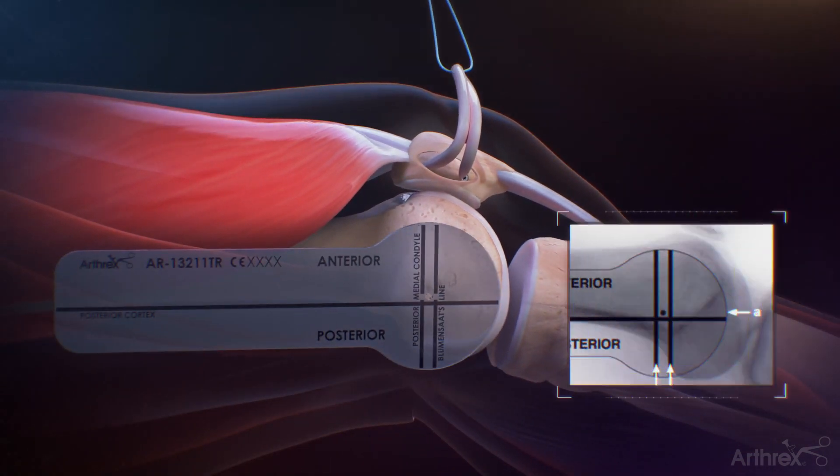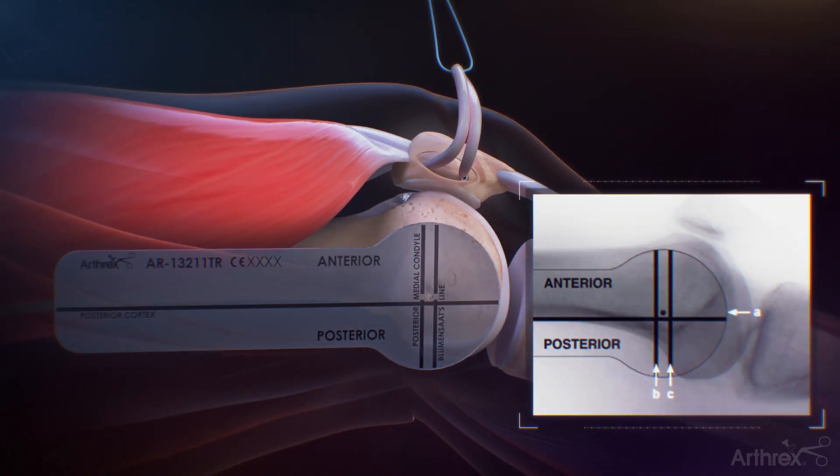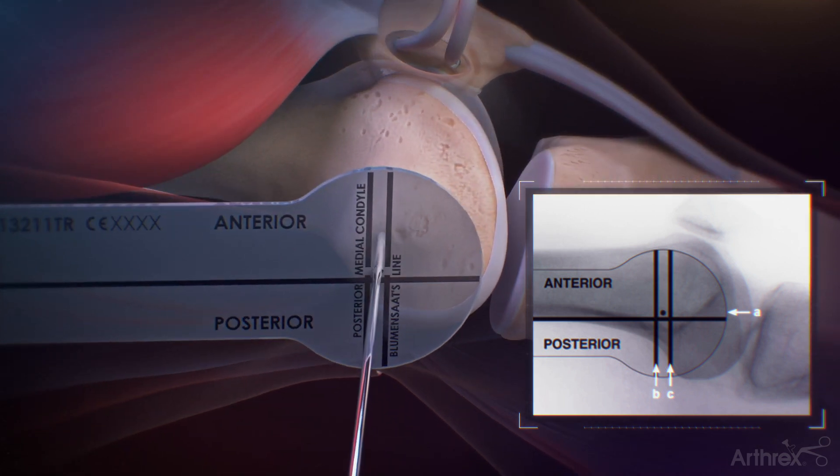A template is placed on the medial epicondyle on the distal femur and, under fluoroscopic guidance, a 2.4 mm guide pin is targeted at Schottle's point and is drilled across the femur and out the lateral epicondyle. The pin should be aimed slightly proximal and anterior to avoid the intercondylar notch.